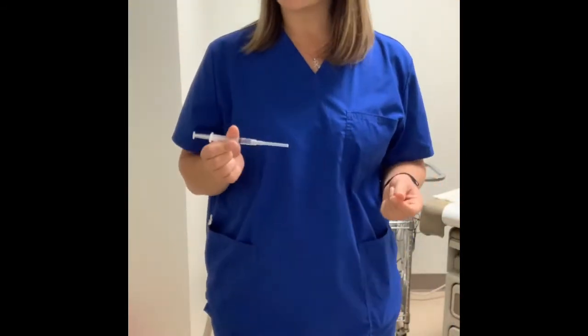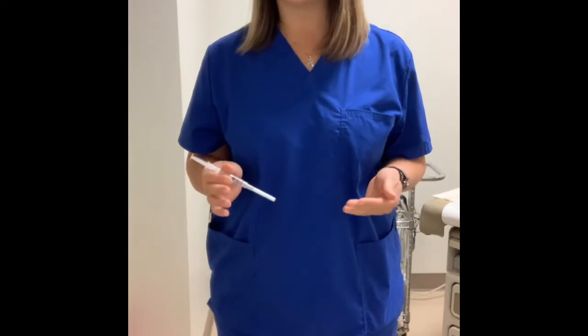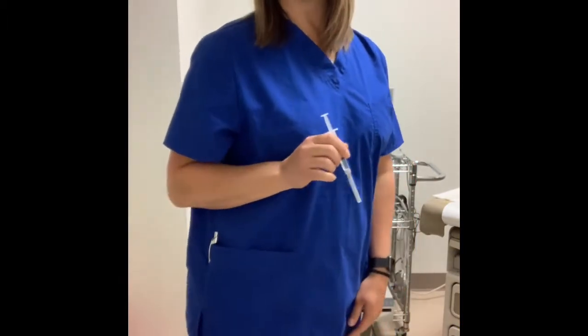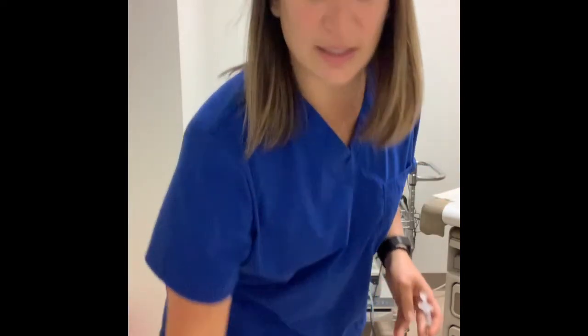You can either give yourself this injection or have someone do it for you. If doing it yourself, you can sit down and cross your leg, or lean up against a sturdy table or wall. Once seated with your leg crossed, take your alcohol swab, wipe the area you're going into, let it air dry, and then in your dominant hand — generally the right — hold the syringe just like this.